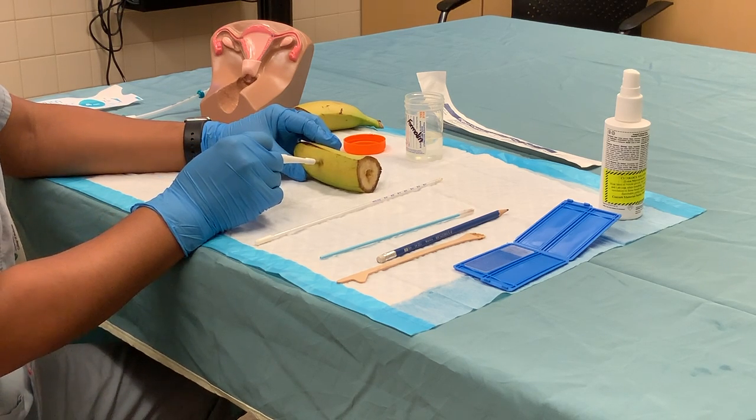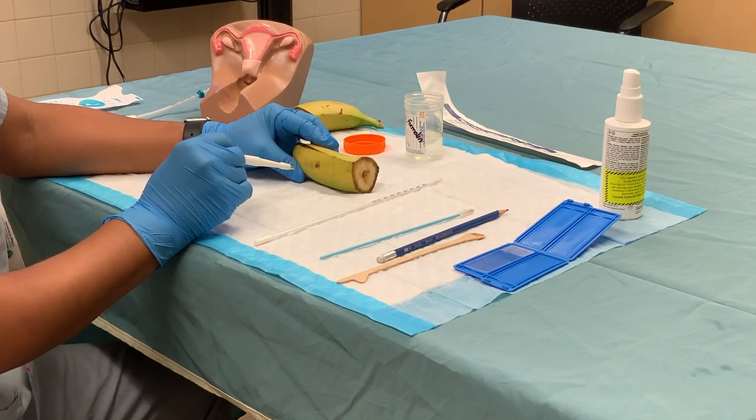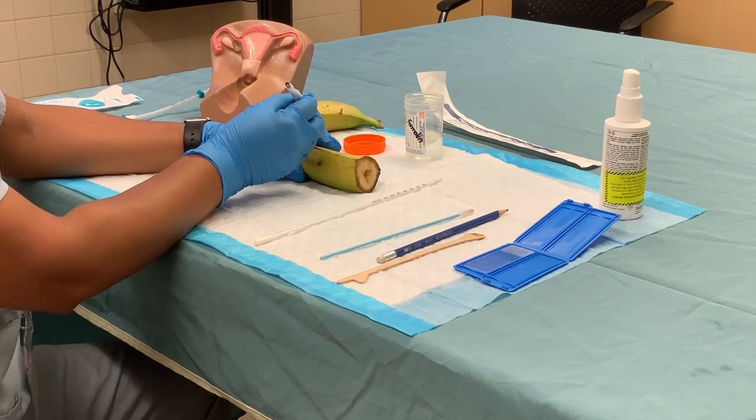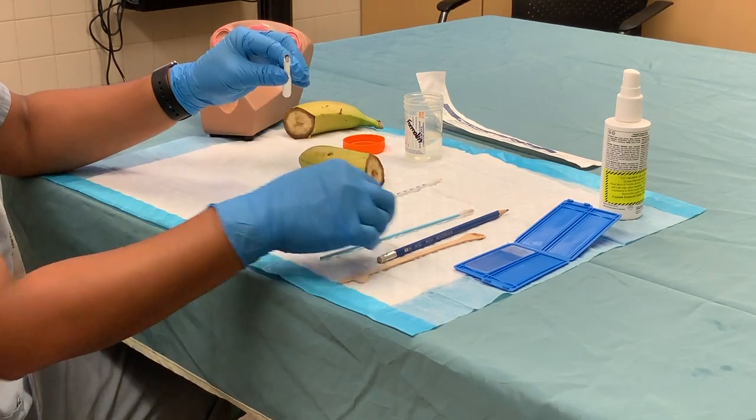You only want to see part of the metal portion disappear into the vulvar skin. In a screwing fashion like this, gently apply pressure, then pull straight out — the tissue should be right at the tip of the instrument.